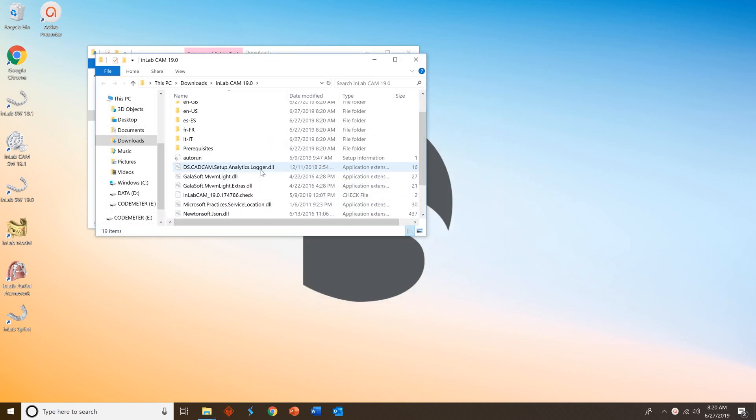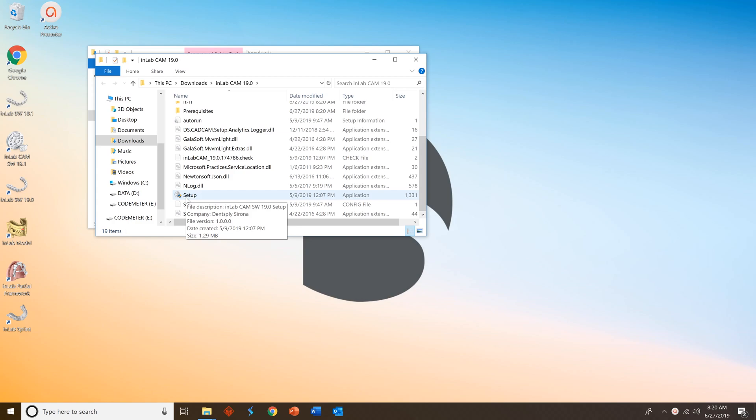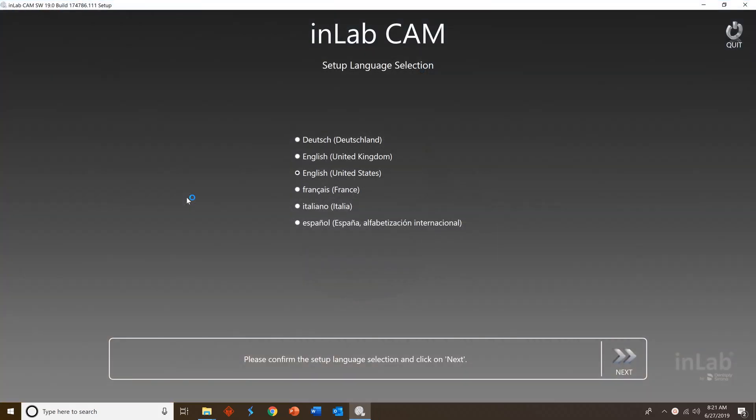Navigate to the setup icon and double-click that to get the process started. The InLab CAM will open and then select your language, in our case English United States, press next.